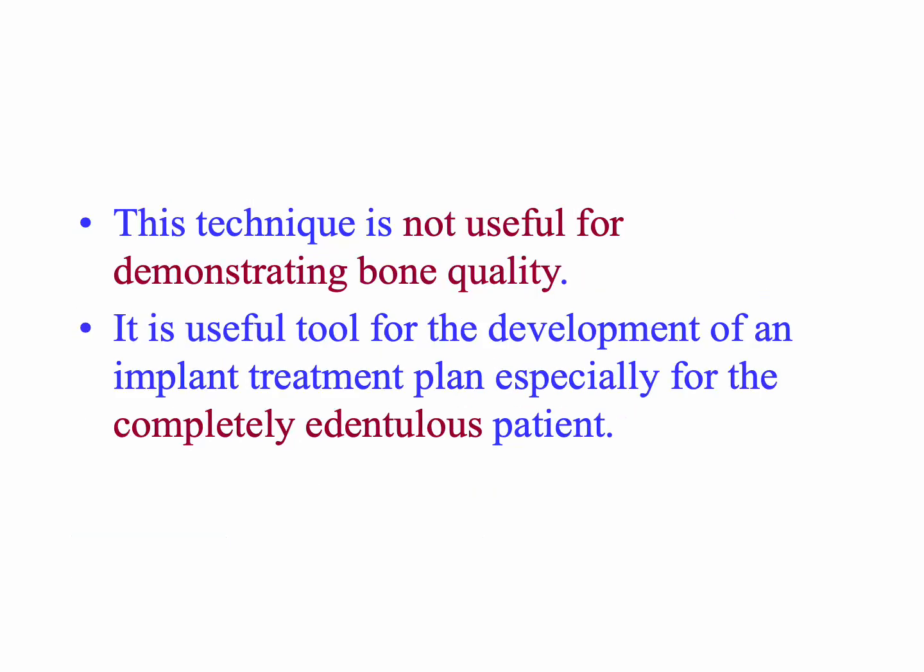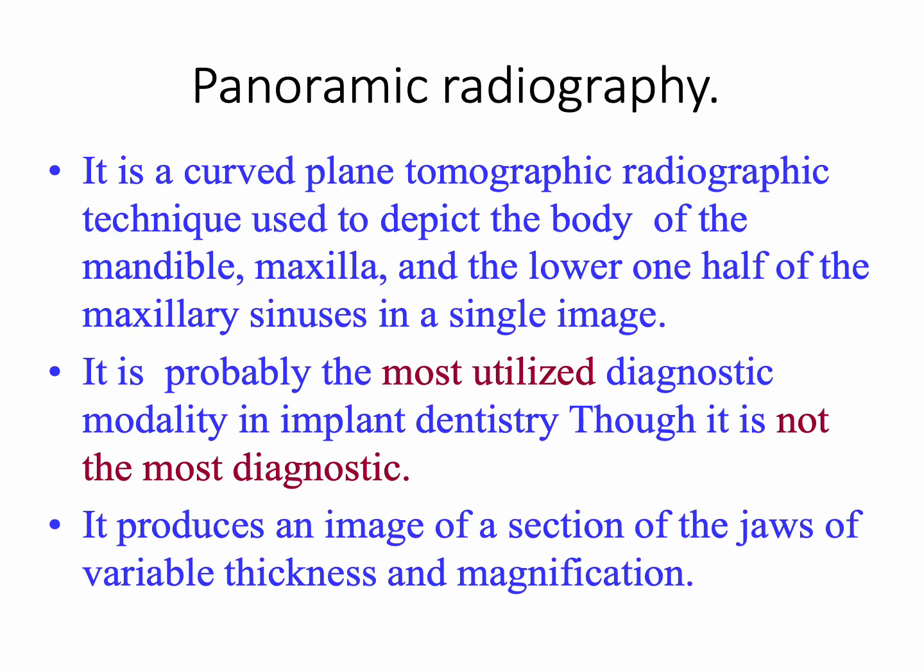This technique, however, is not useful for demonstrating the quality of bone. However, it can be recommended for placement of implants in completely edentulous patients.